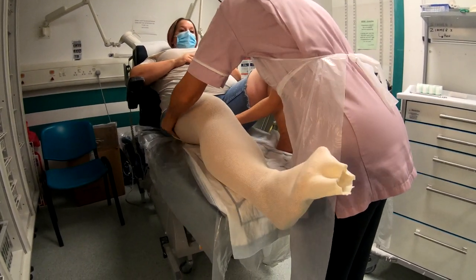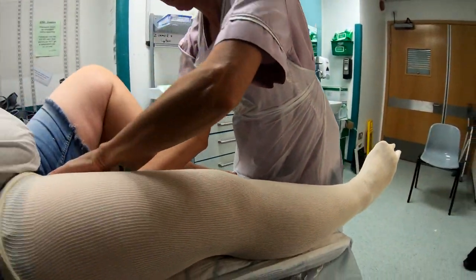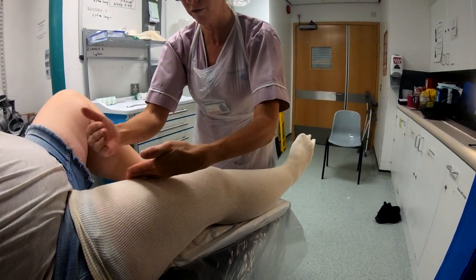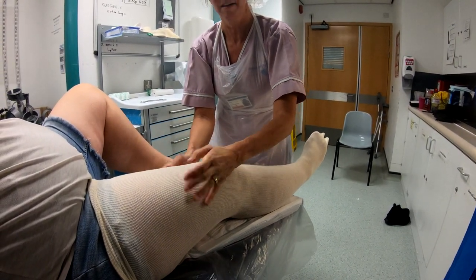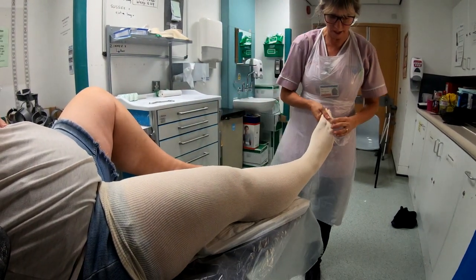This sock has to go really close to the groin — get nice and close. It's a little bit personal, but you need it as high as possible, because otherwise when you fold it back, we want the cast to finish here. We don't want the cast to finish just above the knee, so it's really as close to the groin as you can manage.